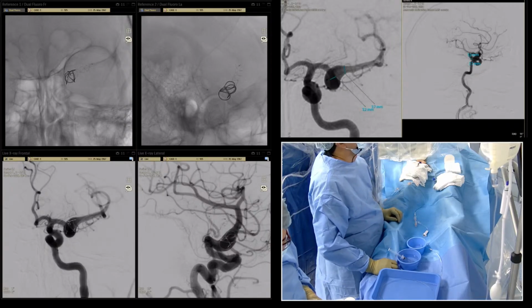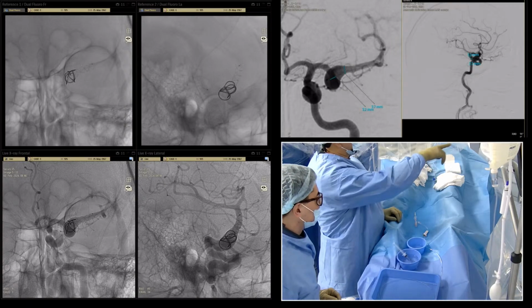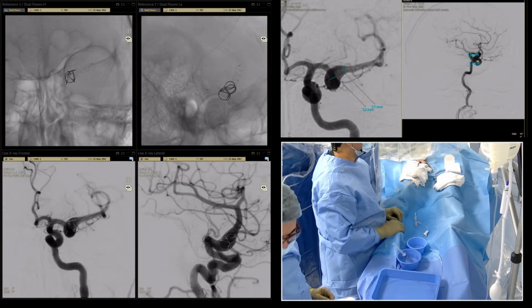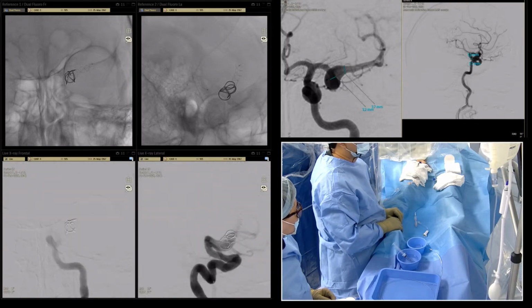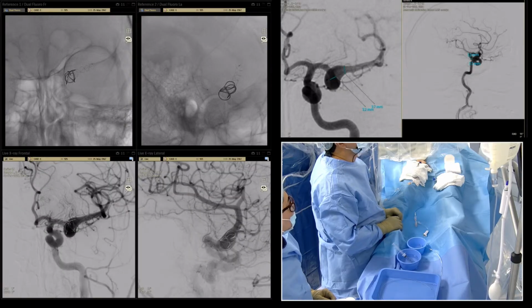This is option number 3. Yes, we have now the position of the little baby is nice. The last baby is quite distal. The second one is inside the first one, and we may place another one. Which one is better?